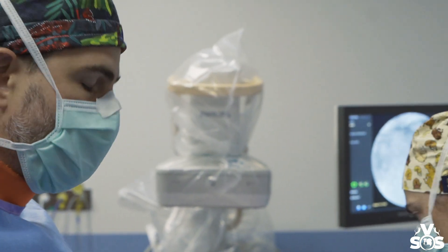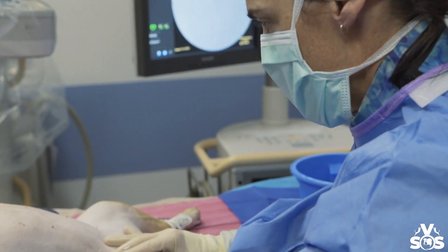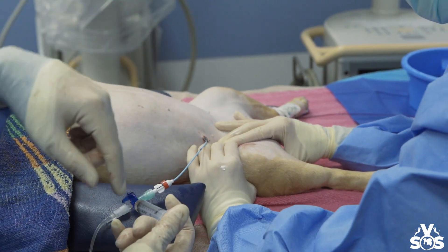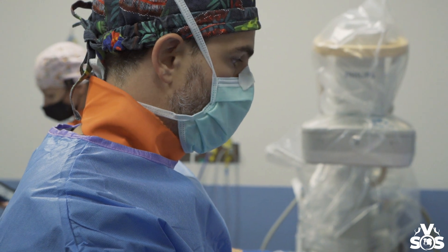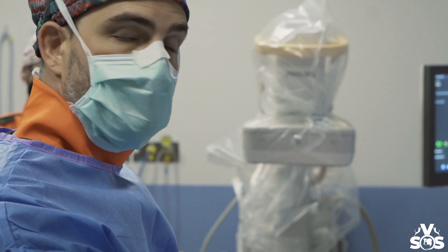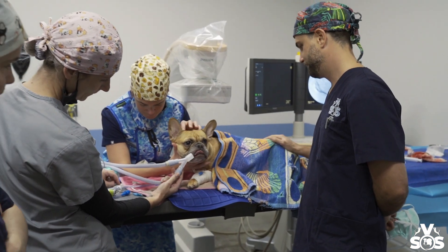We got to treat one area of the tumour, and we hope that helps the dog improve a little bit in symptoms. You can see the tumour there — that's the tumour. We expect some of it to die off as a result. That's hopefully the goal, and with the part that dies off, hopefully this gives her a few more weeks or even months, if very lucky. But it's a very late stage where we're doing this treatment, unfortunately. Hopefully we have good success — we have seen huge surprises with good outcomes in other dogs.